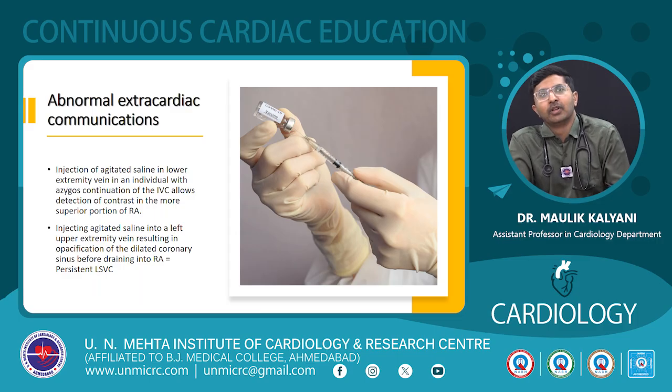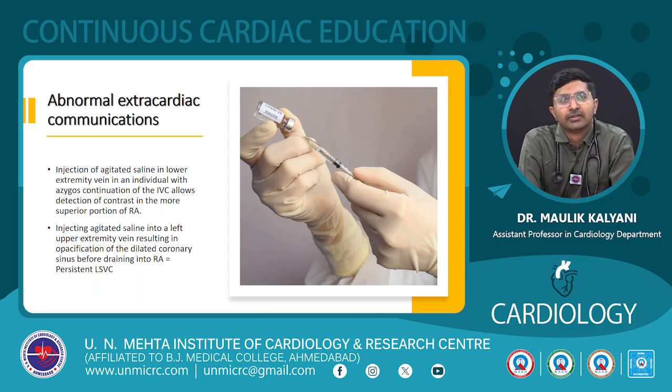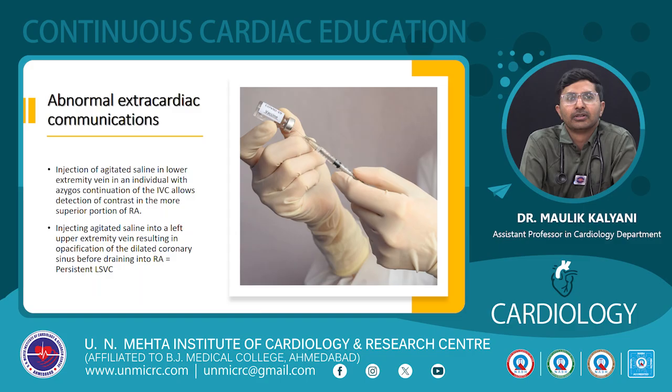So then there is abnormal extracardiac communication. Injection of agitated saline in the lower extremity veins in an individual with azygos continuation of the IVC and interrupted IVC will show the contrast in the superior portion of the RA. So it is suggestive that the blood is going from the IVC, then to azygos continuation, then draining into the SVC, and then opening into the RA.